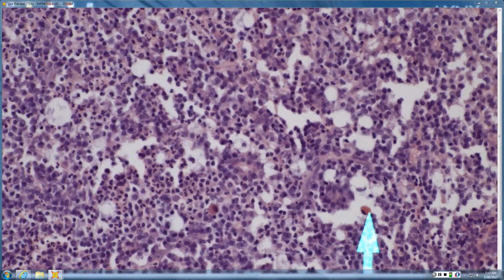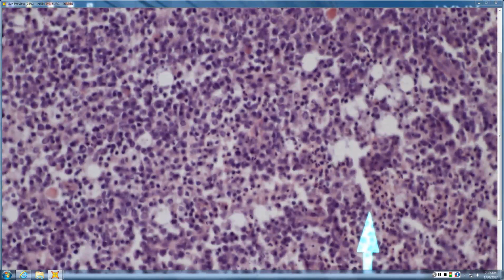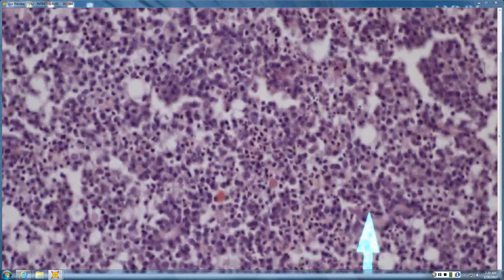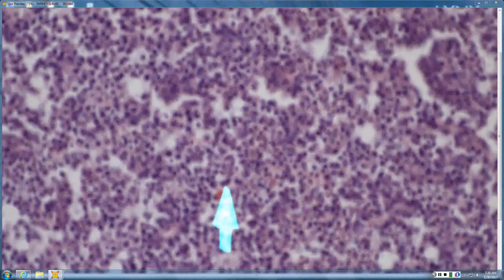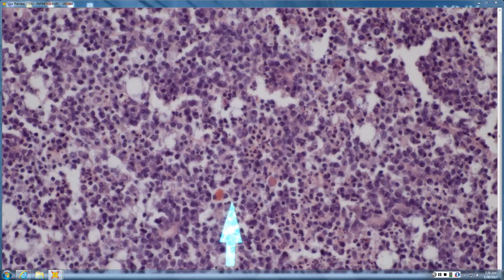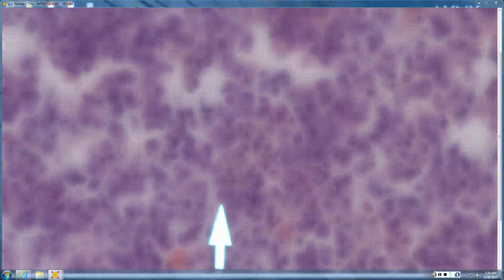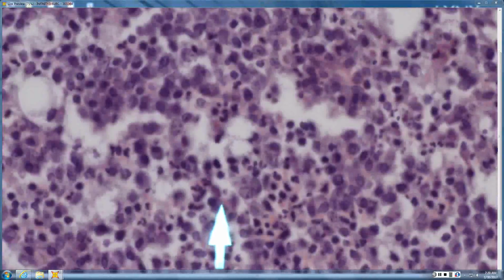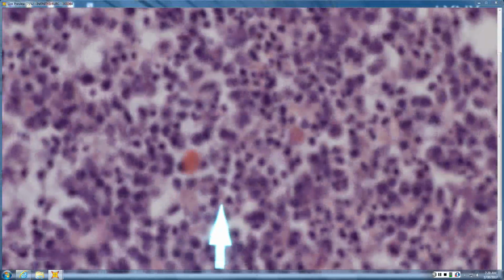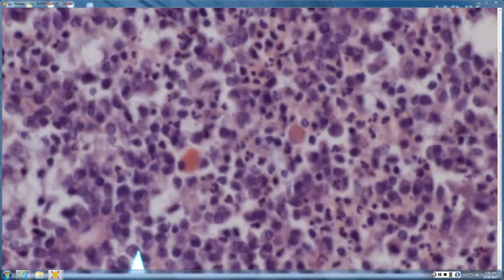You don't really see those with Rhinoscleroma. What you see in Rhinoscleroma are the Russell bodies. But if you hear those other bodies being talked about, the Dutcher bodies and Mott cells, those are other variations on plasma cells. But in Rhinoscleroma, you're seeing this infectious background, lots of plasma cells, and then Russell bodies. And these are for first years who are still trying to learn what plasma cells are. These are always good slides to look at because there are tons of plasma cells all over that are pretty easy to see.